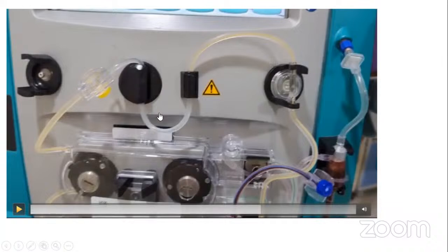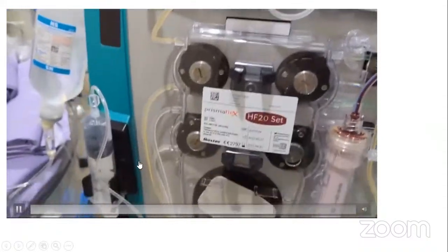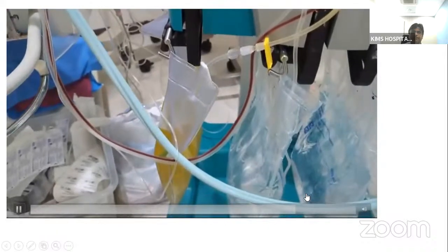Any blood in this effluent will be detected here, and automatically the machine will stop and produce an alarm. After this, it goes through the effluent pump, and from this pump the outflow is directed to the effluent bag.